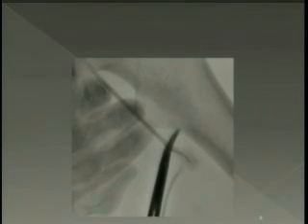And so we go to the sheath. We sort of pull it out towards the sheath. But it got stuck at the valve of the sheath. It could not come out. You can see in the next frame, you have the wire not coming out through the sheath. So we decided we'll pull the whole sheath out. So this is, mind you, an 014 wire, and we clamped the sheath with artery forceps, hoping we also grasp the 014 wire.